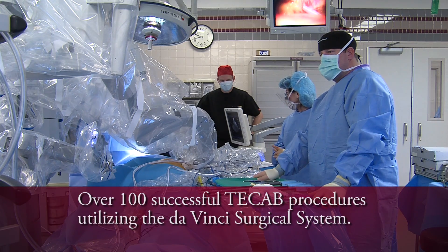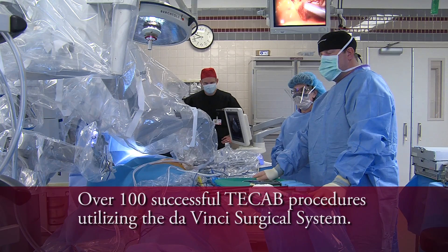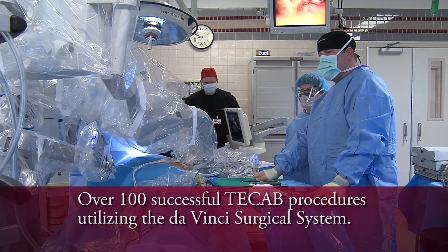We started doing T-CAB around two years ago, and to date have done 100 successful T-CAB procedures.